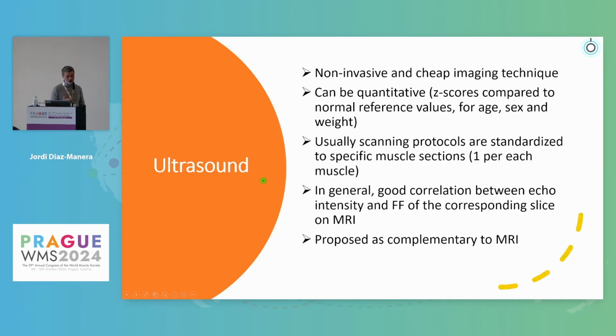So ultrasound is trendy, that's a reality, it is gaining popularity. There are many people that are starting to use ultrasound in their clinics, and there are many reasons for that, of course. And the main one is that it's not invasive and cheap, so you can have a portable device now that you can plug into your phone, for example, and you can just explore your patients while you are doing the clinical examination in your office.